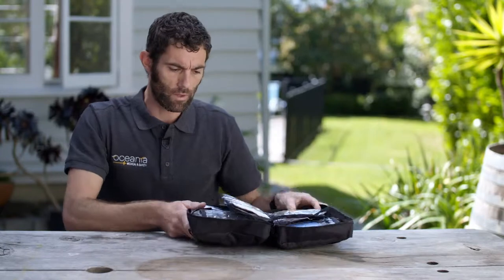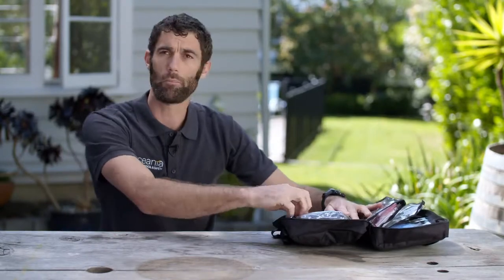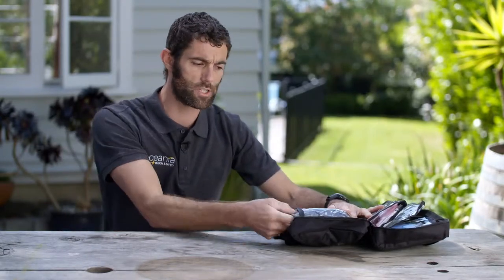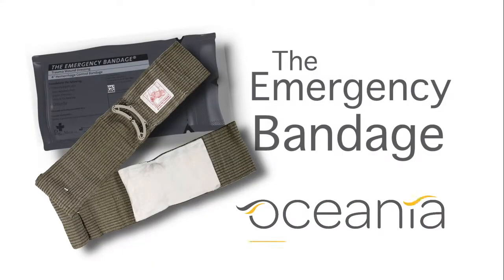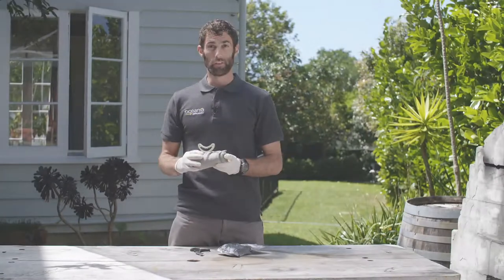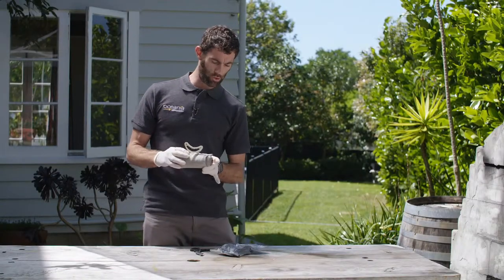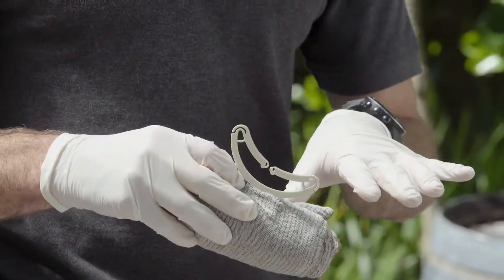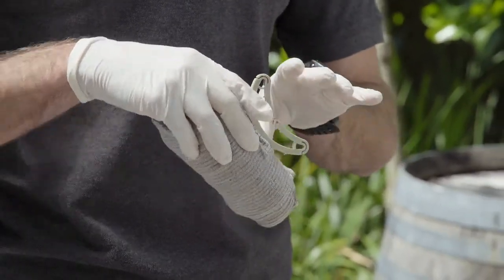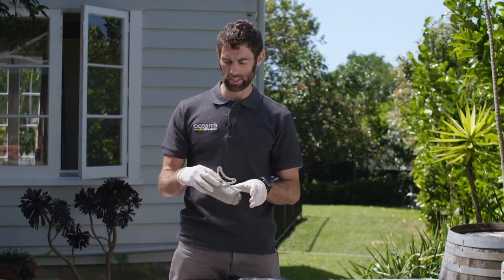To go through it, open it up — we have trauma bandages designed for military use, perfect for controlling bleeds and holding the extra pressure down. The emergency bandage is often referred to as the Israeli or the trauma bandage, designed for putting direct pressure onto the wound after you've put in any Celox gauze or combine dressing.